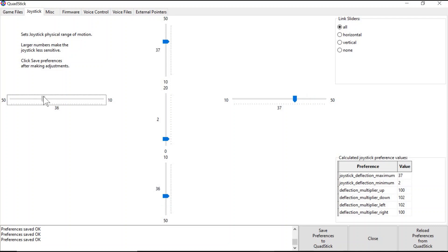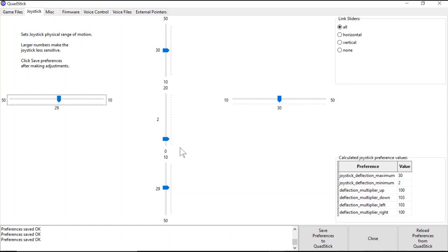I typically start someone off with a sensitivity between 25 to 30. I find this is a good balance of sensitivity when somebody's getting started with the Quadstick. Once you have adjusted the joystick sensitivity, you can save it by clicking Save Preferences to Quadstick, which will save your changes when you've adjusted the joystick sensitivity.